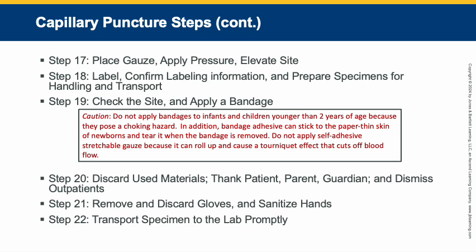Microhematocrit tubes can be placed in a non-additive tube or an appropriately sized aliquot tube for transport with identifying information written on that transport tube. Follow any special handling required, such as cooling in crushed ice for ammonia, transportation at body temperature for cold agglutinins, or light protection for bilirubin samples.